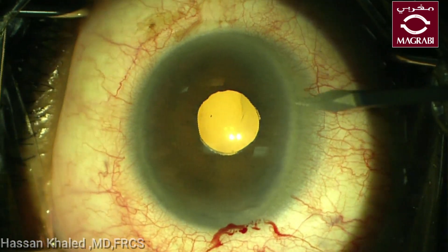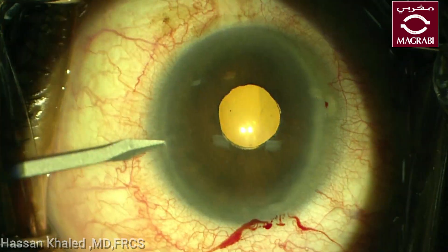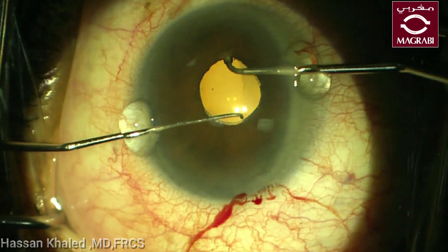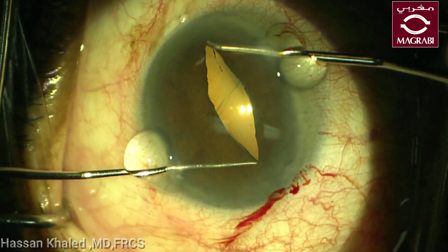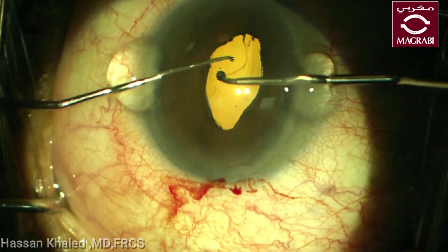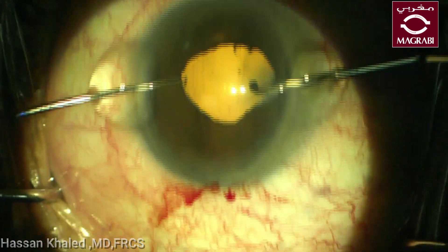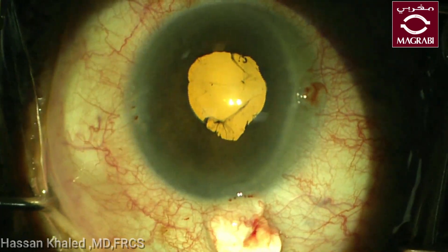Here is the first case of nuclear cataract with narrow pupil and fine pupillary membrane. Here I choose to use a Malyugin ring, but before inserting the ring I stretched the pupil to facilitate the insertion of the Malyugin ring.